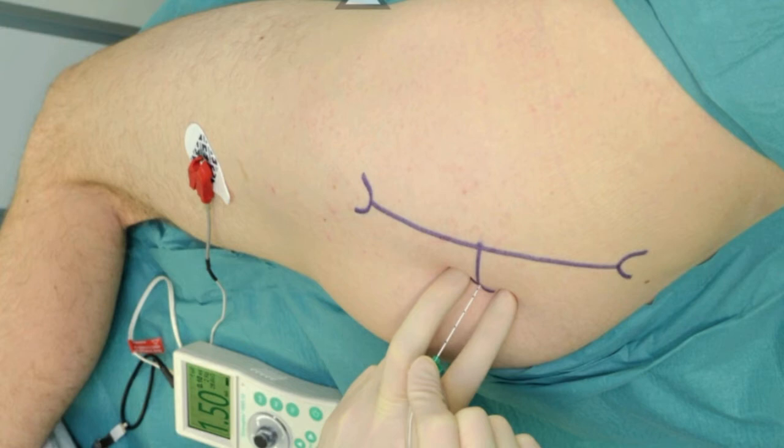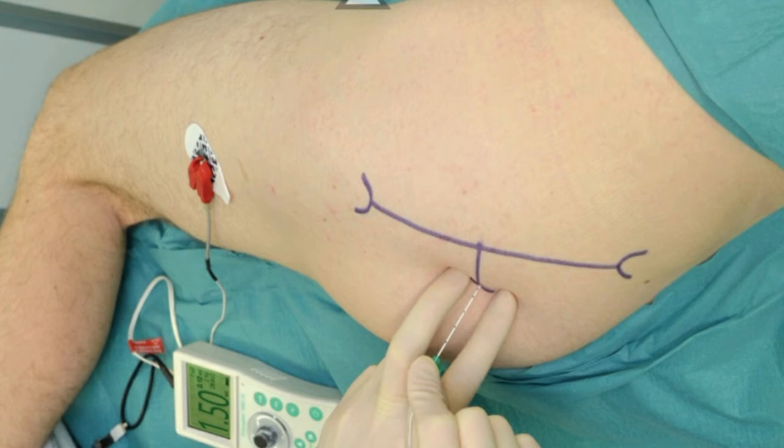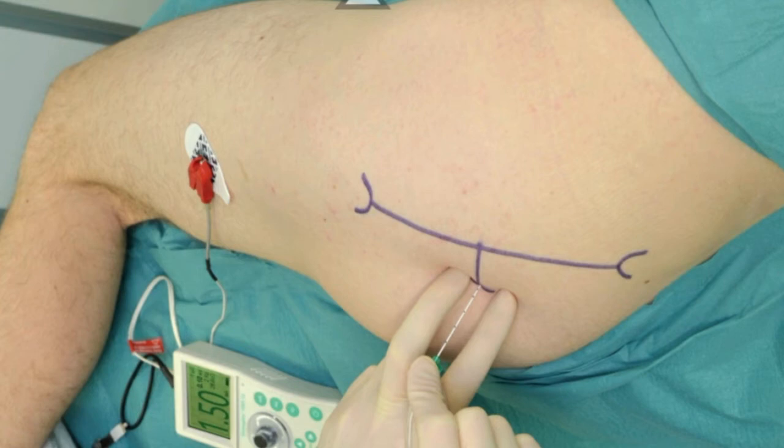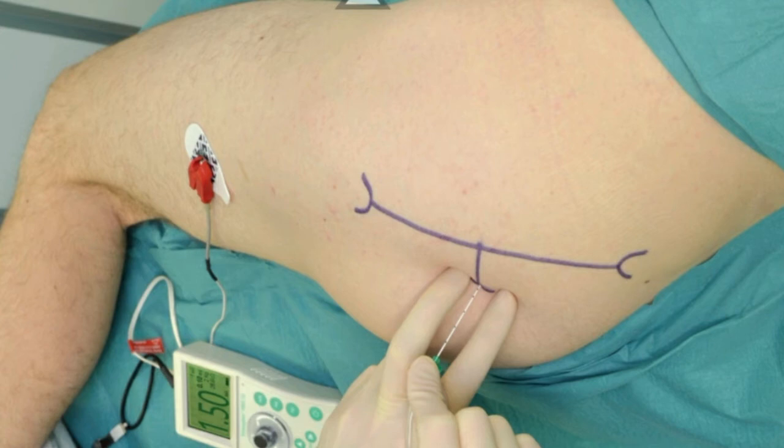Sciatic nerve block may cause patient discomfort because the needle passes through the gluteus muscles. Adequate sedation and analgesia are important to ensure patient comfort. Midazolam 2 to 4 mg can be given for patient positioning, and alfentanil 500 to 750 micrograms is given just before needle insertion.